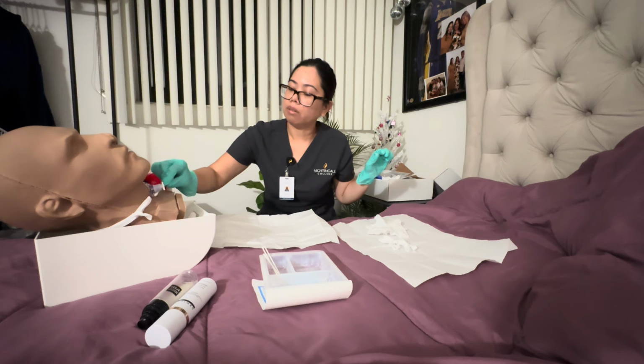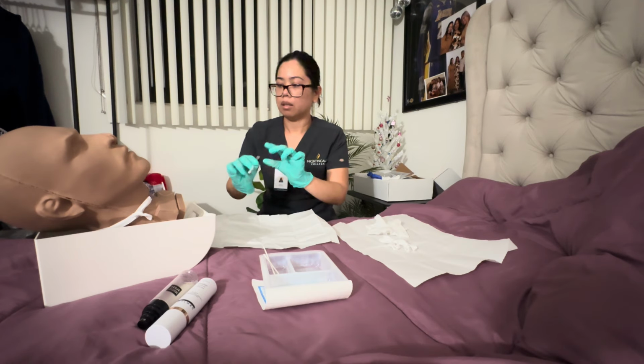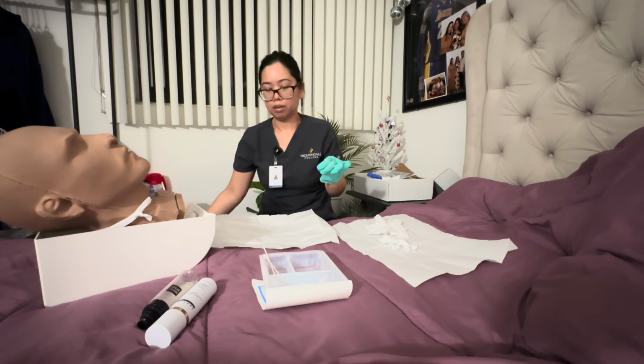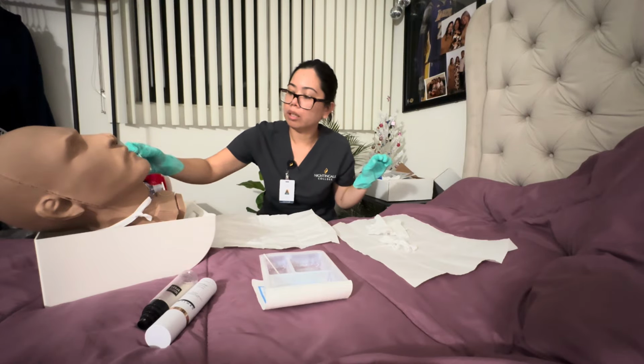Clean outward around the stoma. I'm gonna clean on the faceplate. I'm gonna clean behind the flanges.